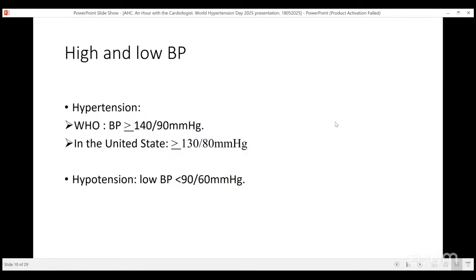Thank you very much. So, you can use any of the hands, and the difference between the two should not be up to 10 millimeters of mercury. We will always take the higher one, because that will prompt action. So if your blood pressure is 140 over 95 on one hand and 138 over, say, 92 on the other hand, we will work with the 140 over 95 so that we can help you with better blood pressure control.